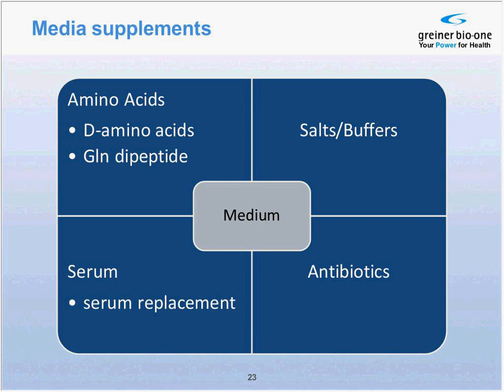There are several serum replacements available. So if one wants to stick to a more precisely or better formulated composition, then these serum replacements are quite a choice. With regard to antibiotics, it's still very common to use them on a regular basis in the medium.